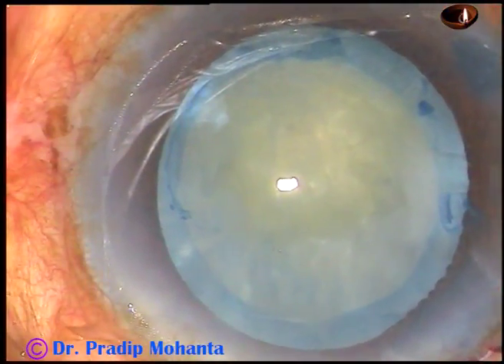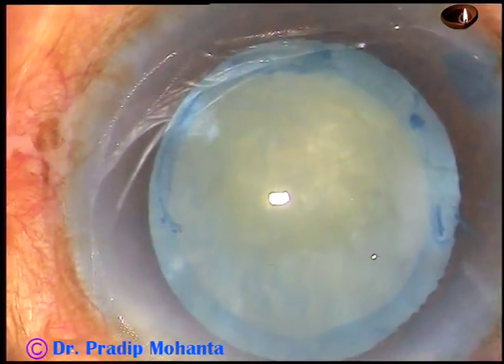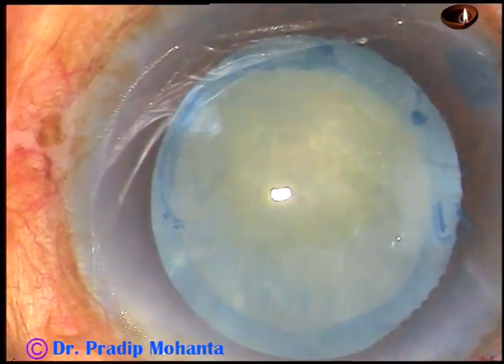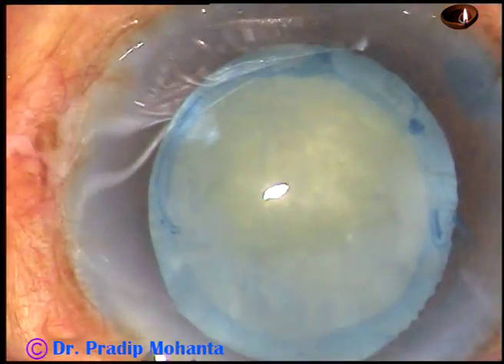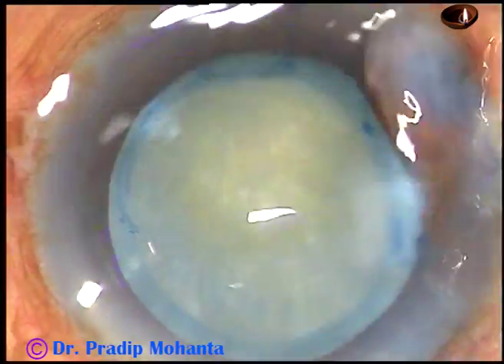You can call this manual femto-rhexis. So if you can improve your skill to a certain level, this femtosecond laser is not required for capsular rhexis in intumescent cataracts.